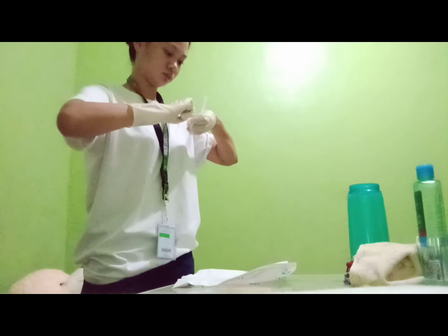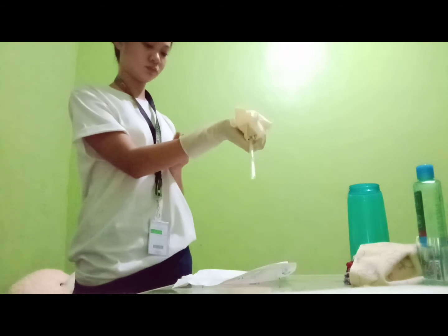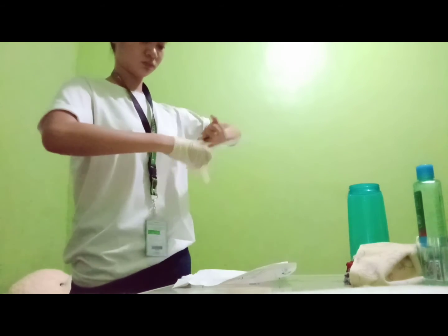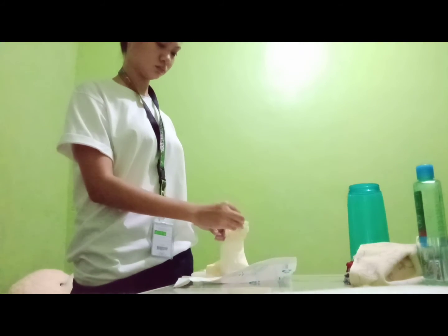Remove gloves by holding catheter with dominant hand and pulling glove off inside out. Catheter will remain coiled inside the glove. Pull other glove off inside out. Dispose in trash receptacle. This contains client secretions inside gloves to reduce transmission of microorganisms.